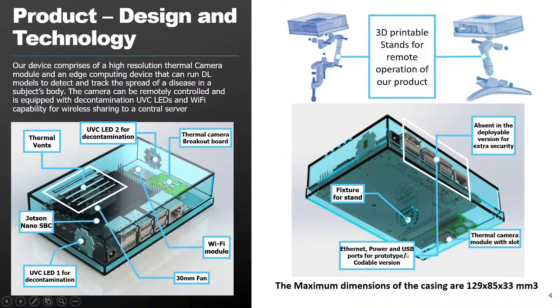We are planning two variants. One will be with access to the USB ports and all the cords and Ethernet, and one will be a deployable version that will prevent connection to these ports for extra security.